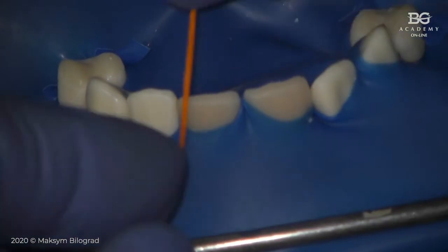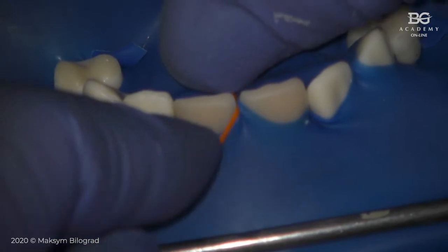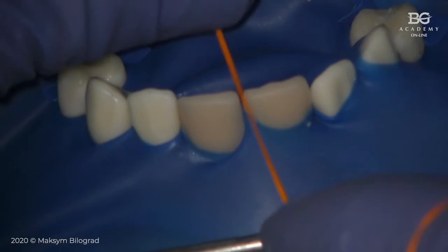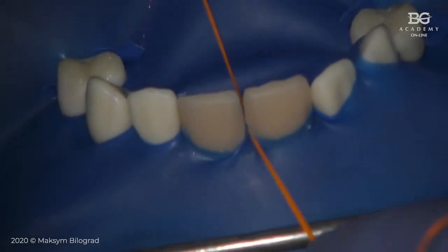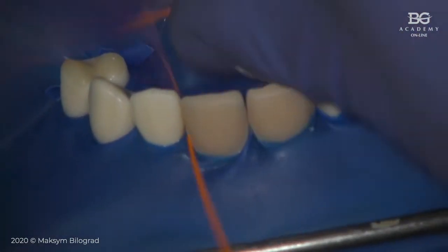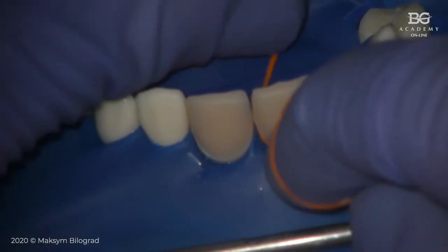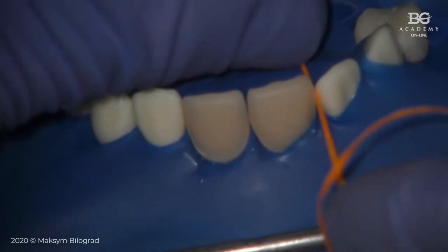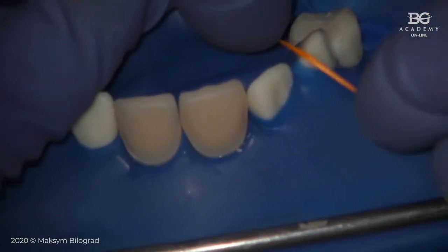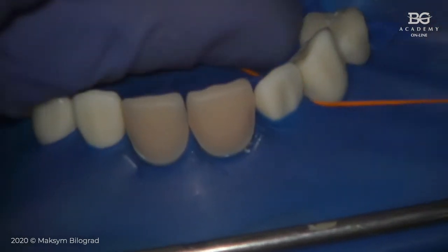So you take floss, and with floss we go between teeth, one by one, like this. Move it to the sulcus, move to the sulcus here, see, forward and backward, one more time, forward and backward, done. Same here, forward, backward, pull out, from the distal area, forward, backward, pull out. Then we continue, canine, lateral incisor, same, forward, backward.